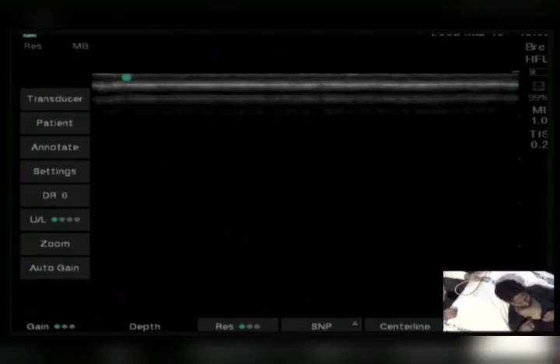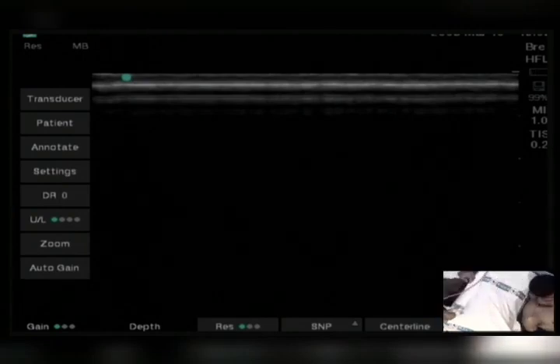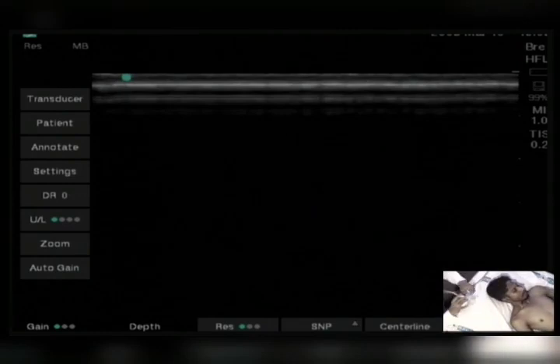Then I will go with costoclavicular. By the time we scan, why do we inject in the corner pocket? Question to all of you. Anyone? Ulnar nerve, or it's a lower nerve, lower trunk, right? To prevent that. And what is the traffic light appearance? C5, C6, C6. Very good. It is not C7, right?